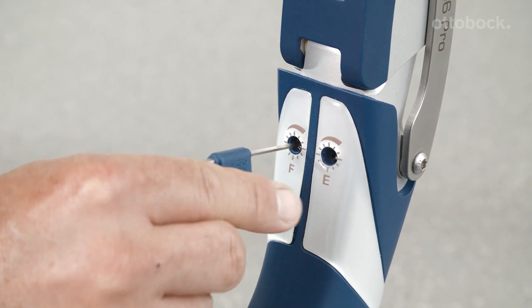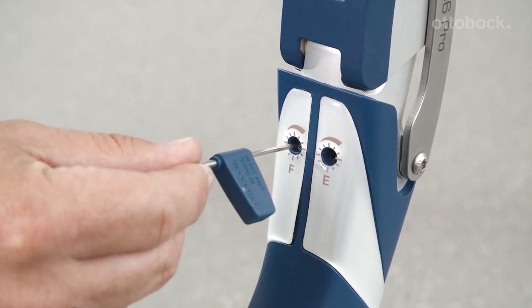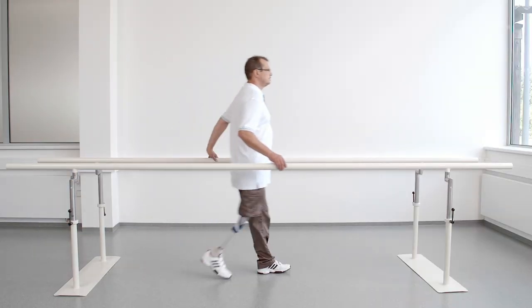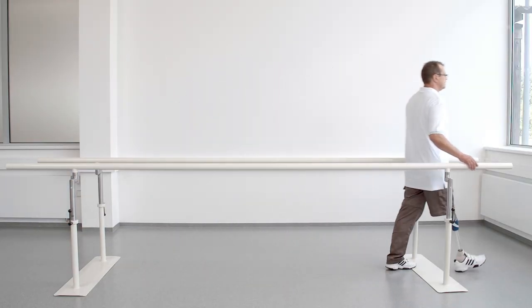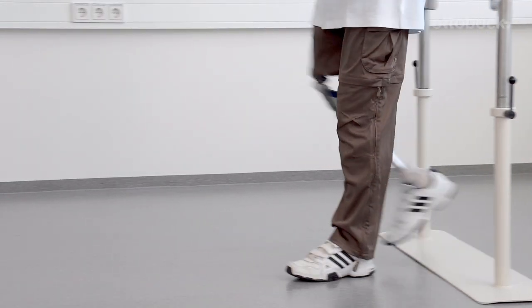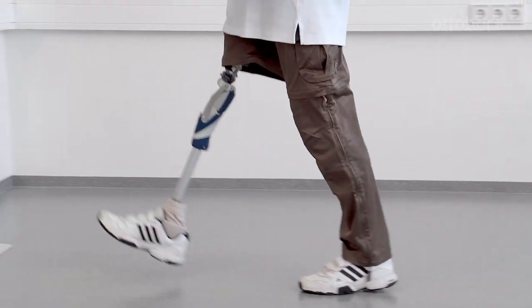The optimal setting of the damping is reached when the user doesn't have to wait for the prosthesis to reach full extension at heel strike, and the prosthesis doesn't reach its full extension too early. The knee flexion angle of the contralateral side provides a good orientation.